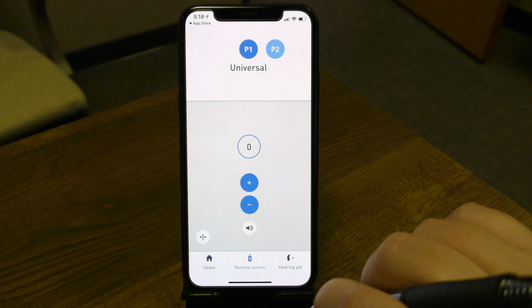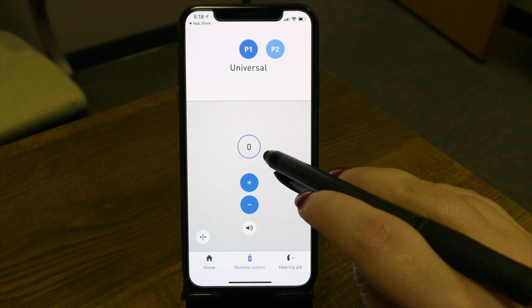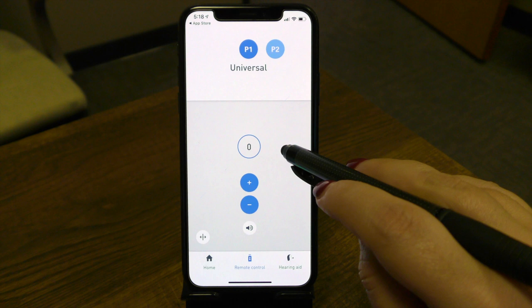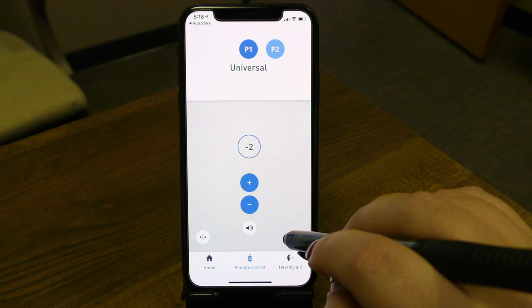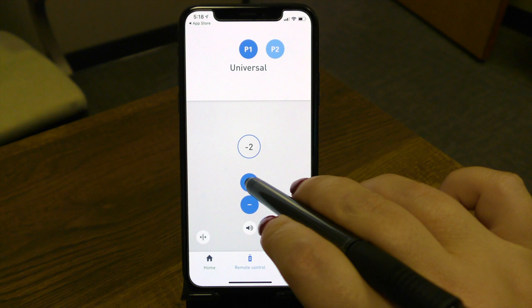That zero does not mean the device is muted, nor does it mean there's no volume coming through. It simply means the hearing aid is at a kind of midpoint. These are your preferred settings, and you can still turn the devices down from this point. That zero is just indicating that you are using the prescribed settings that we, as your provider, have programmed into the devices.